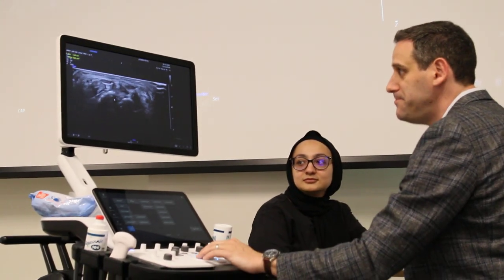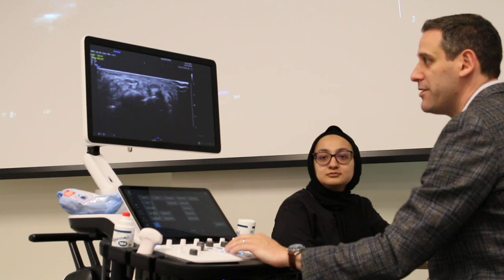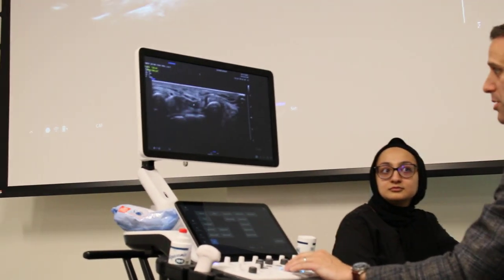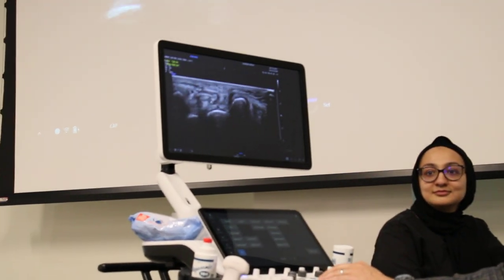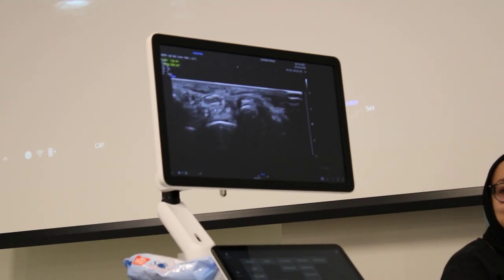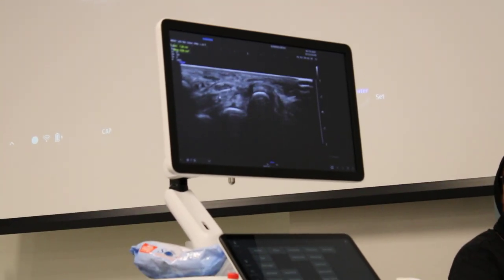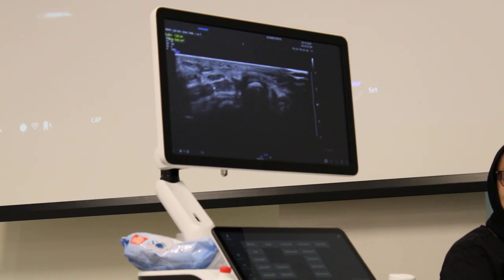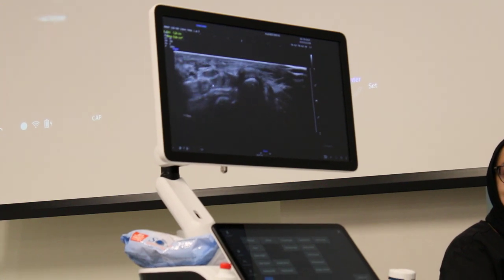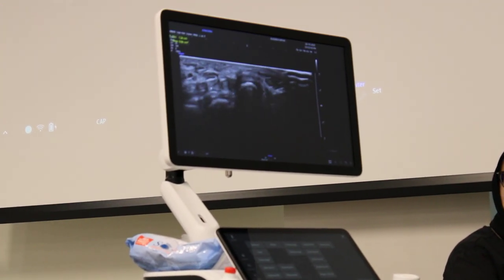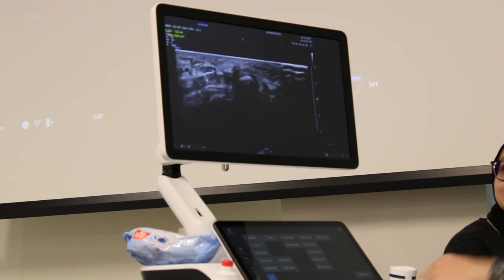We know how many millimeters the nerve is swollen if the person has carpal tunnel. We can also see how that nerve moves. So these are her tendons here — do you want to move your hand, Nikina? So we can see what things are causing the nerve to be pinched and swollen. Open your fingers up. These tendons are just some examples of things that we can see on her ultrasound.